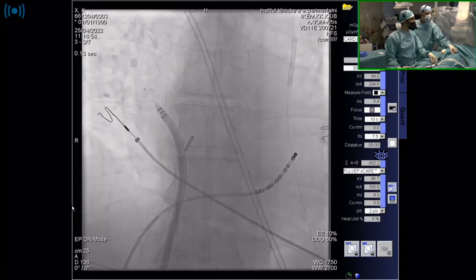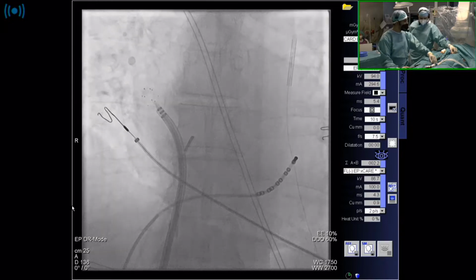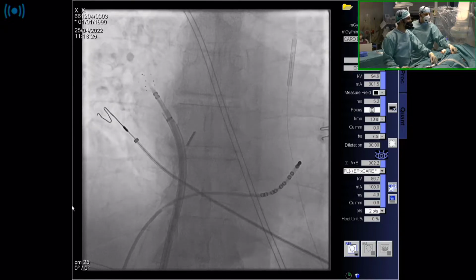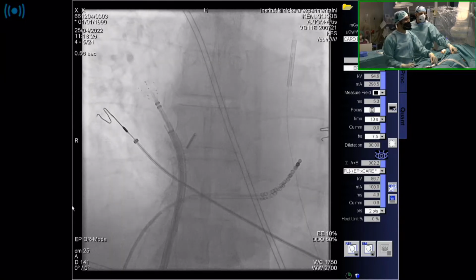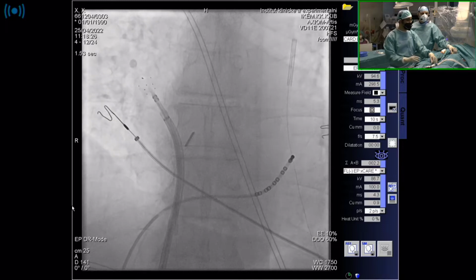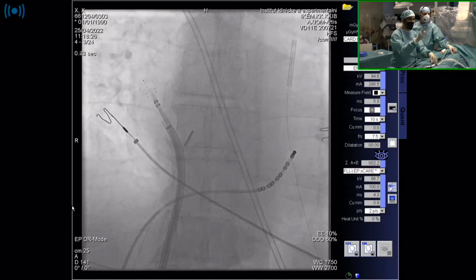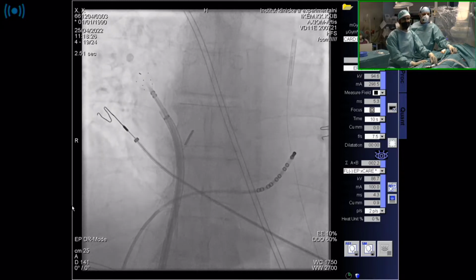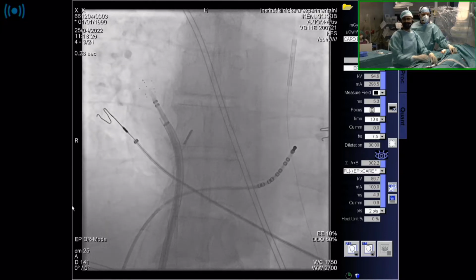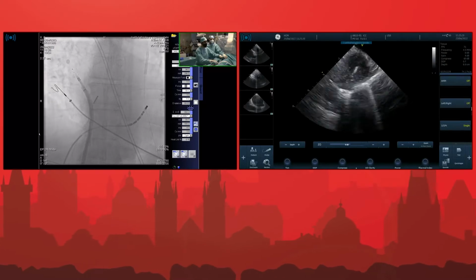Let me just stop on fluoro. You can see where the sheath is, and you can see where the catheter is, and it's now at the os of the right superior pulmonary vein, so it's very easily seen on fluoroscopy, but it is also very nicely seen on ICE. It has very nice echogenicity. Maybe you can see the ICE in the conference.